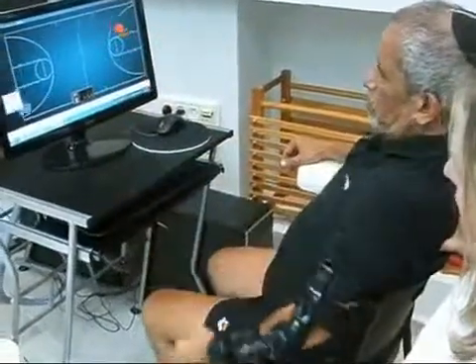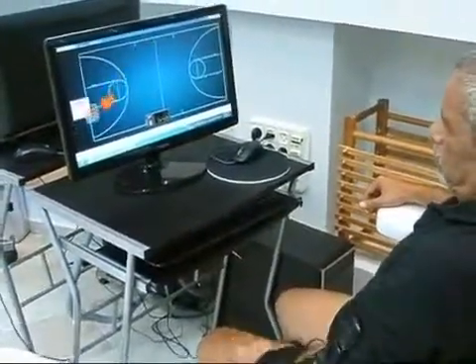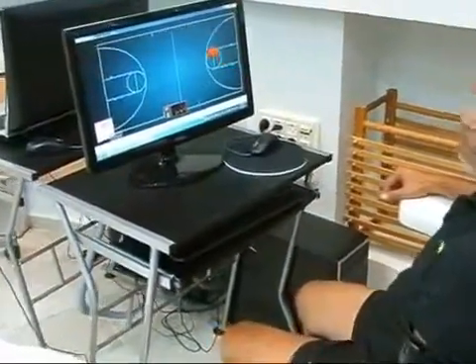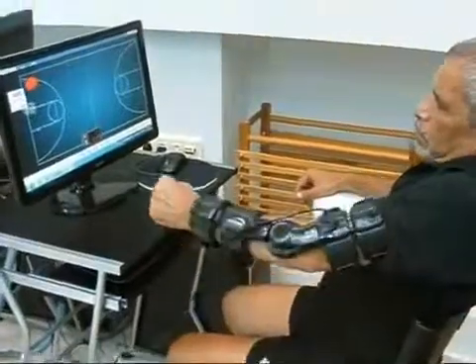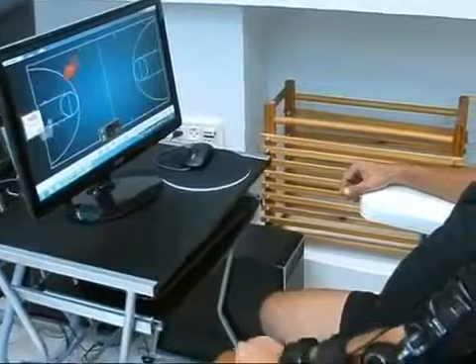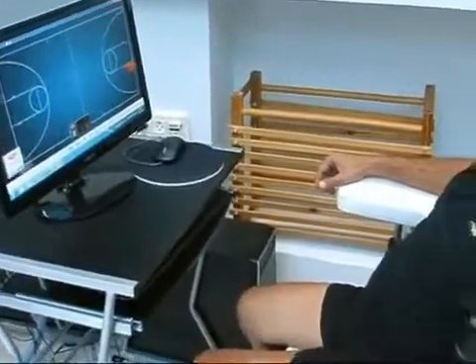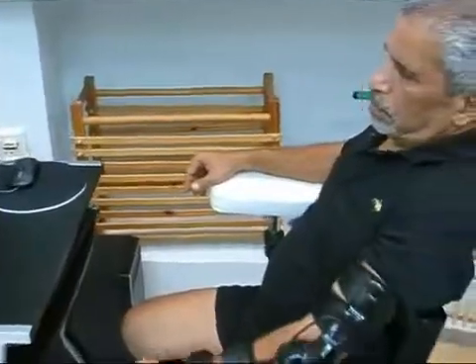Here we see the patient performing intensive active shoulder flexion and extension exercises according to his movement ability. The system allows the patient to practice repetitive active exercises in the form of motivating and challenging rehabilitation games.